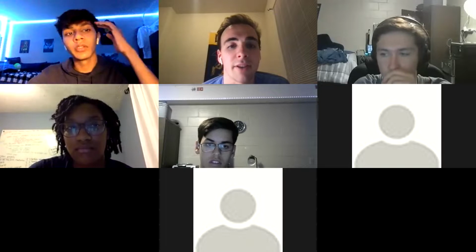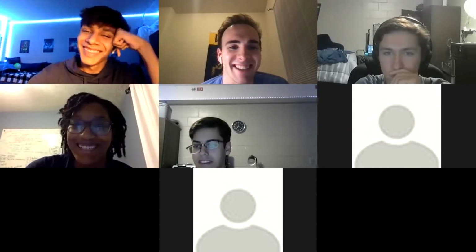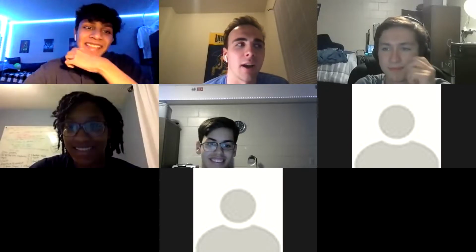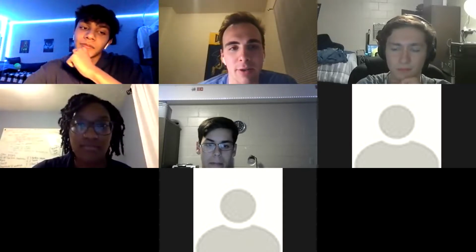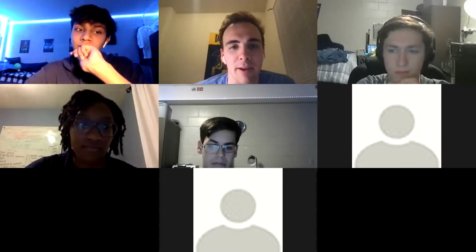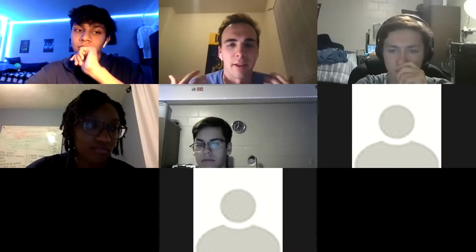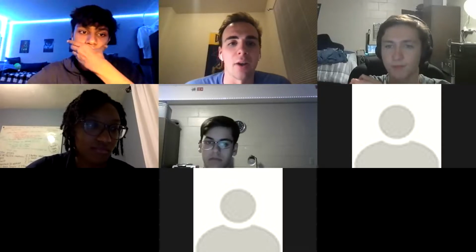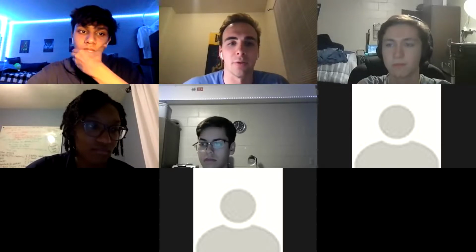I've done a singular image to test it. I'm not there yet. Something I didn't talk about is how we have a manifest file for the images. We're not going to segment every single image, because some images are just of the neck and of the torso below the lung. I don't want to generate more files than I have to, so I have to figure out how we're going to filter through that.